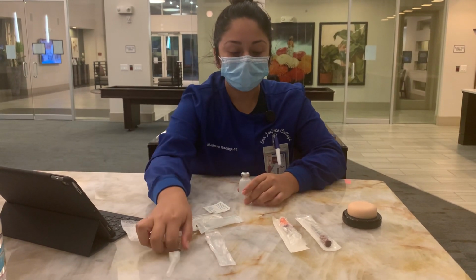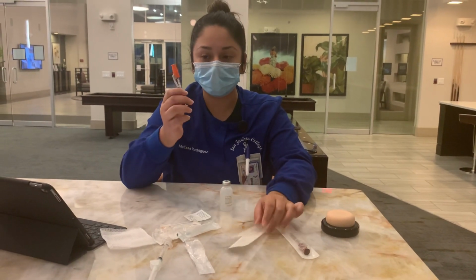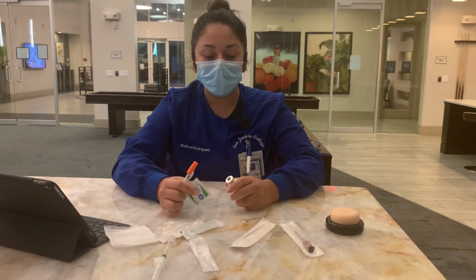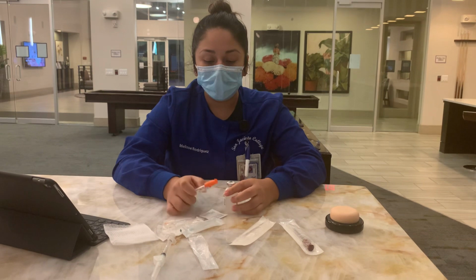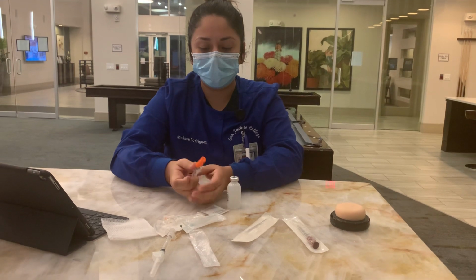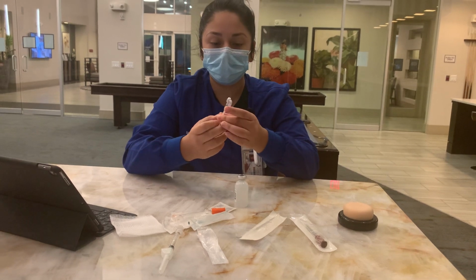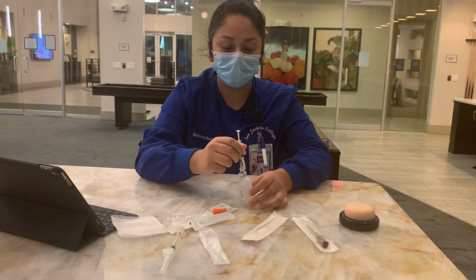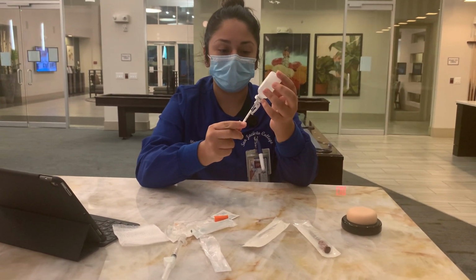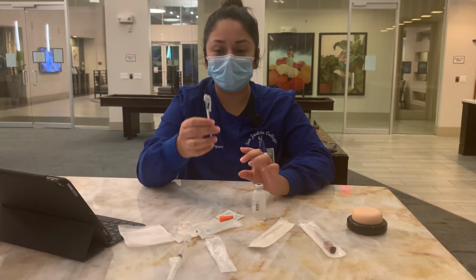Now for my subq, we're going to do insulin 10 units. I'm going to make sure I have my insulin syringe. I'm going to do the same thing with my vial, remove the cap, and clean it for another 10 seconds. Once I've done that, I'm going to remove the cap of my needle, draw back 10 units of air, insert it into the vial, push the air in, and draw back 10 units. Once I've done that, I'm going to assess for air bubbles on my needle.